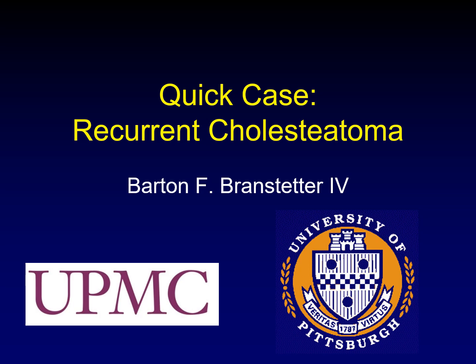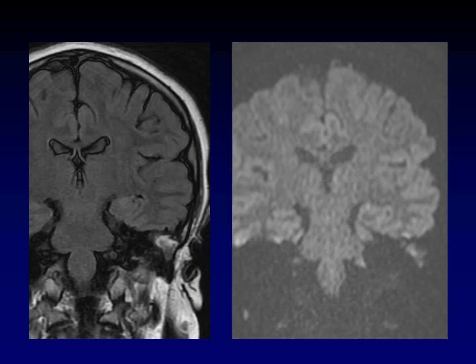This is a case of a 17-year-old male who has had a cholesteatoma that has been resected, and now they're concerned about a recurrent cholesteatoma. Here are the critical images. This is a coronal T2, and you can see some things in that evacuation pocket, the mastoidectomy bowl. And here on the diffusion-weighted images, you can definitely see something.